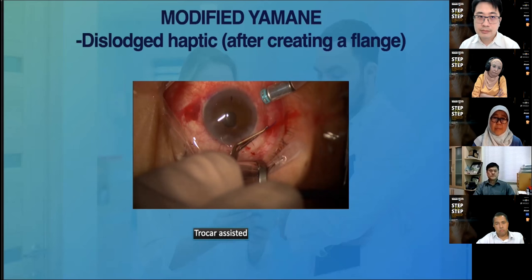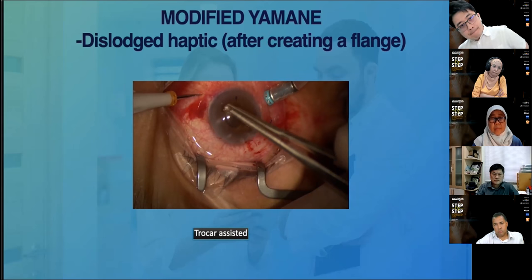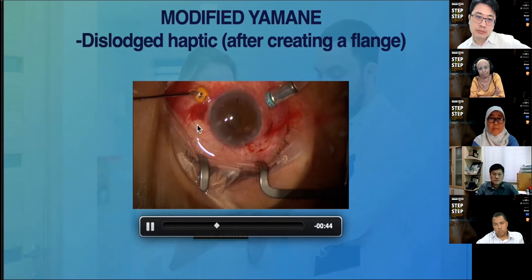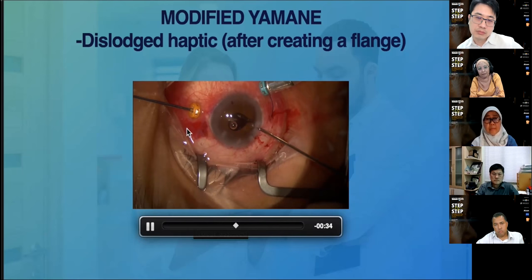Now, I find it also useful to use the same technique in case we have a situation whereby the haptic is dislodged, especially after we have created a flange. Occasionally, we might end up with this situation, especially in the first few cases. Expect that might happen, so at least we know what to do. Sometimes when we are externalizing the second haptic, in case we have created a flange for the first haptic, we might accidentally give too much force that causes the initial haptic to dislodge inside the eye.